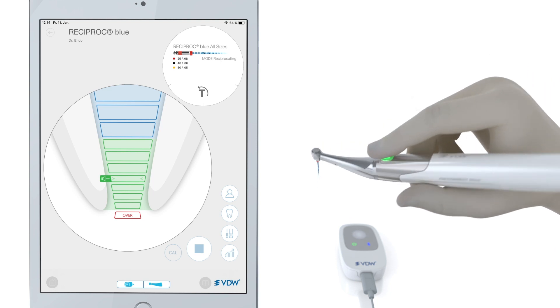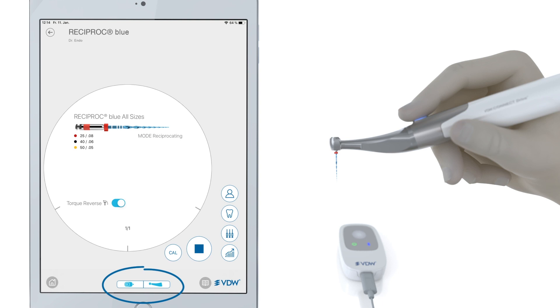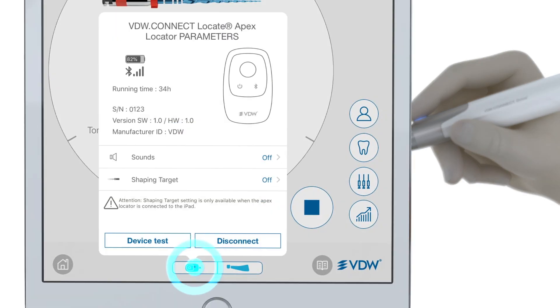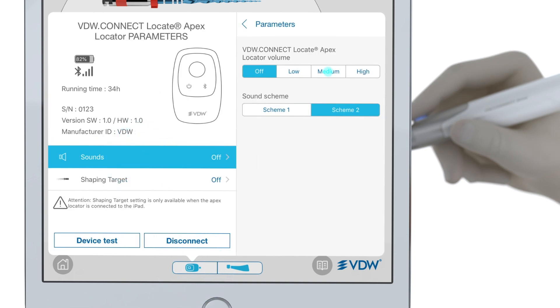To customize your devices, you can access all respective parameters by clicking on the two icons at the bottom of the app. Selecting the apex locator icon allows you to access the sound settings, where you can adjust volume and tone.